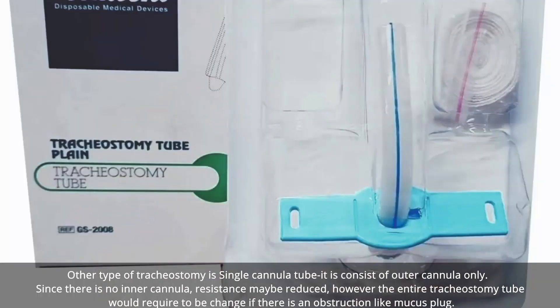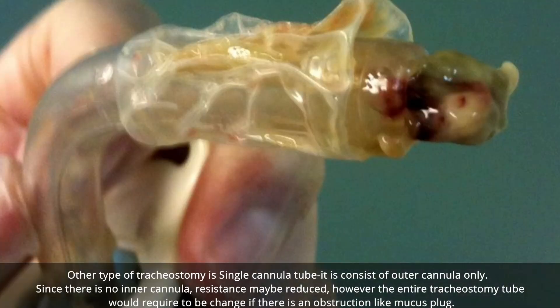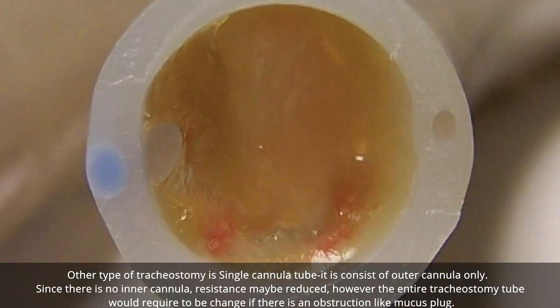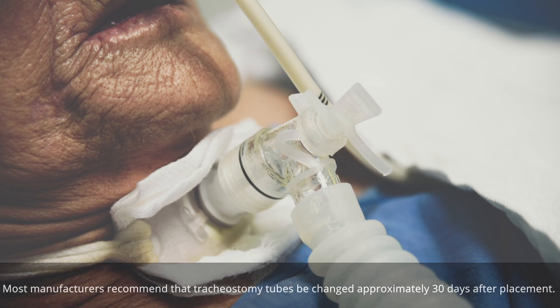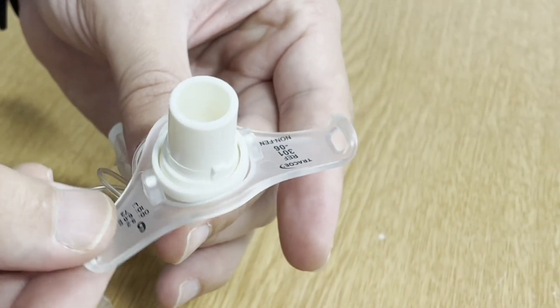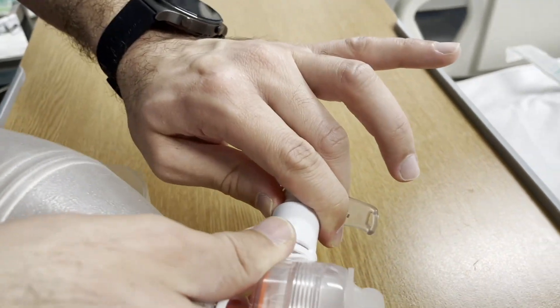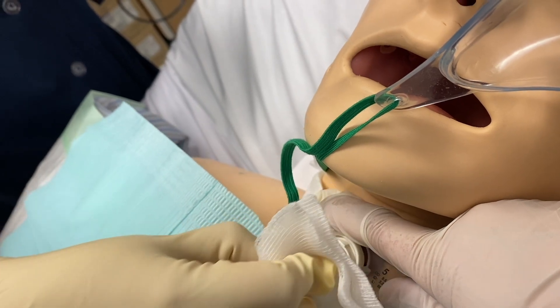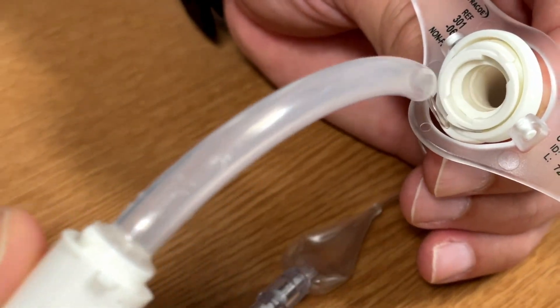Another type is the single cannula tracheostomy — there is no inner cannula, consisting only of the outer cannula. Since there is no inner cannula, resistance may be reduced. However, the tracheostomy must be changed if there is an obstruction like a mucus plug. Most manufacturers recommend changing the tracheostomy tube approximately every 30 days after placement. When connecting an ambu bag or mechanical ventilator, always hold the tracheostomy with your hand to avoid displacing it.